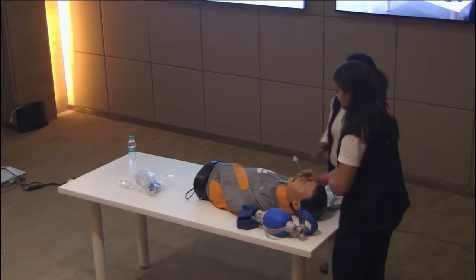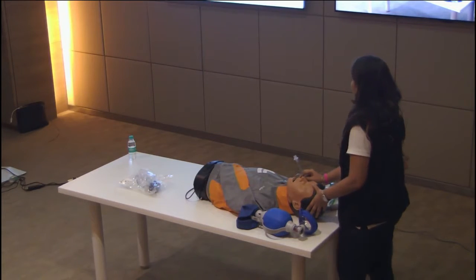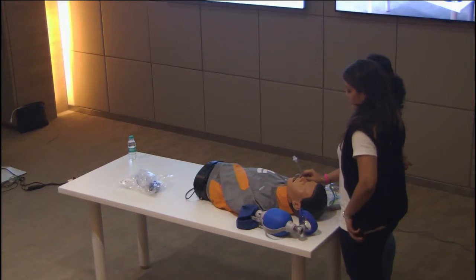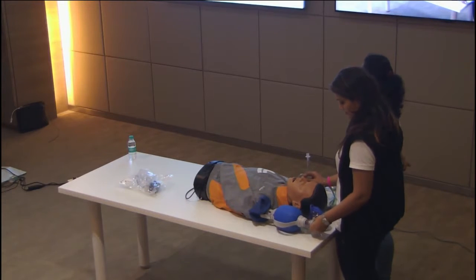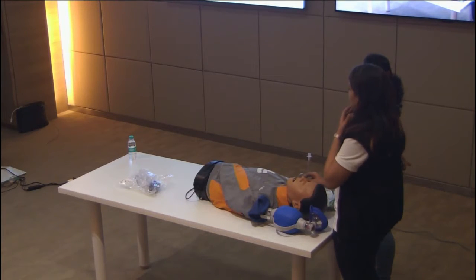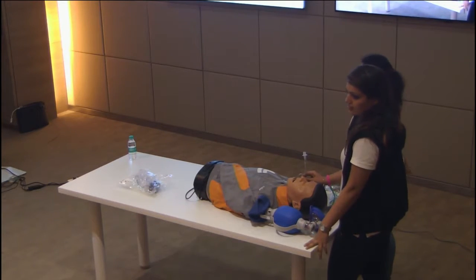All right. So she went from a situation of a saturation less than 86, from a nasal cannula to a mask to an NRBM, and now she's in a frustrating situation where we've just intubated this patient. What have we missed out here? Can anyone tell me what we have missed out here? In this last part, what did we forget? Before the NIV, is there something that you'd like to say about what they've missed out here?